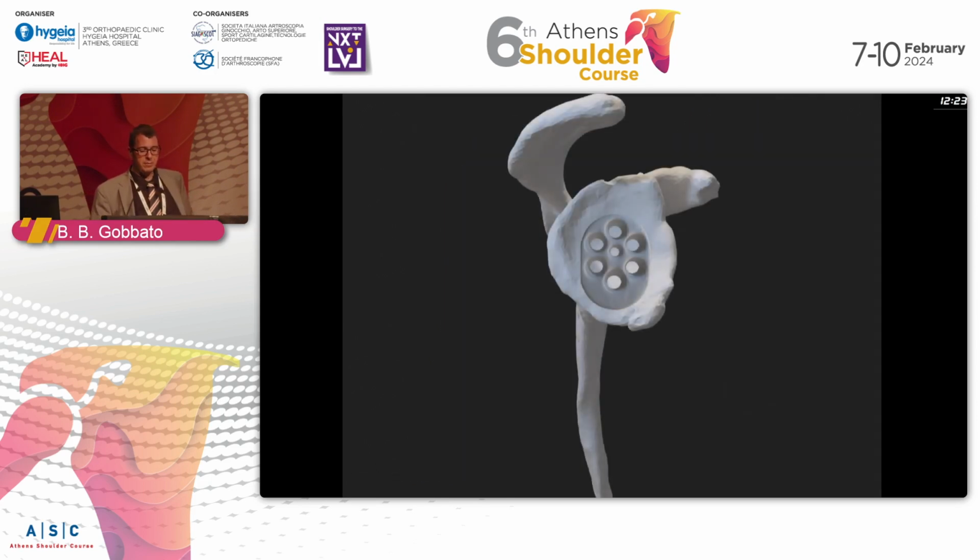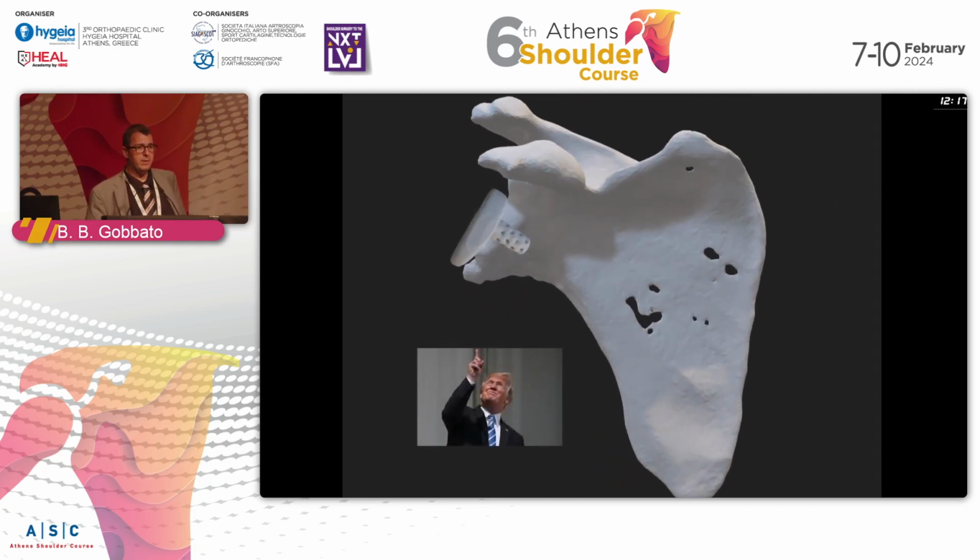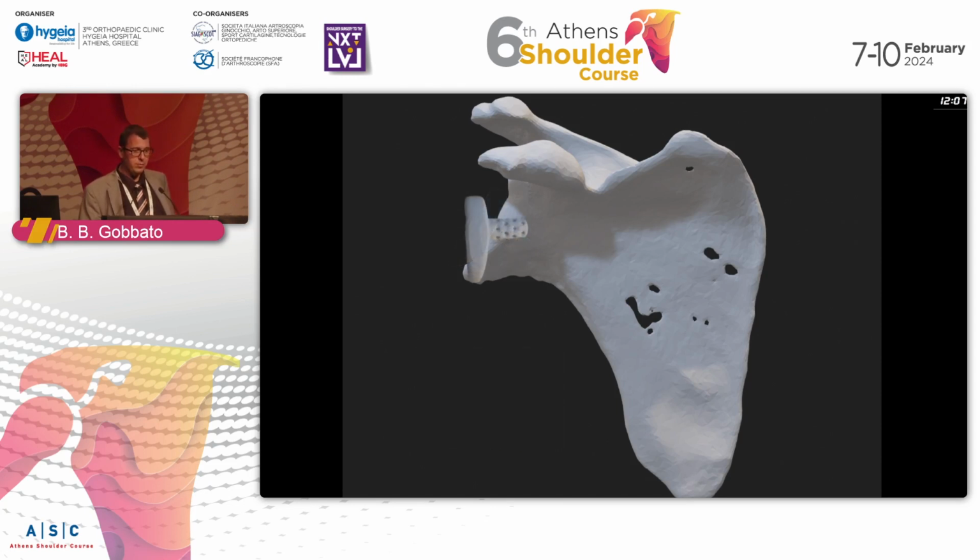Okay, let's use our force. Let's put the implant, lots of osteophytes. Bang, it's looking upside. So if you don't plan, you're going to do something like that, although with some inclination, okay, but not like that. So we have to do it like that. Now we have a challenge. We're going to medialize a little bit, we're going to lateralize with graft, whatever you want. My choice would be metal in this case, so I would do like that.